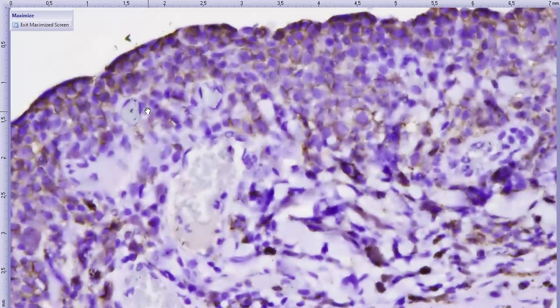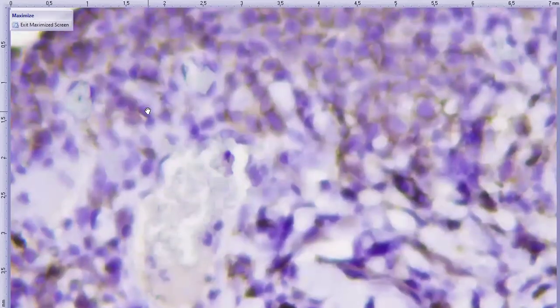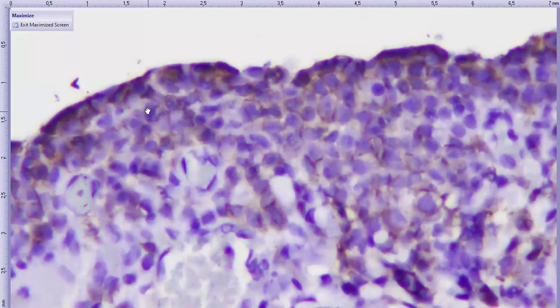And we have a nice diffuse membranous staining of these neoplastic cells for CD20. Uveal lymphoma for this kitty cat. As was mentioned earlier, these can potentially be part of systemic disease, or they could be just primary ocular lymphomas. Presumed solitary ocular lymphoma is potential.